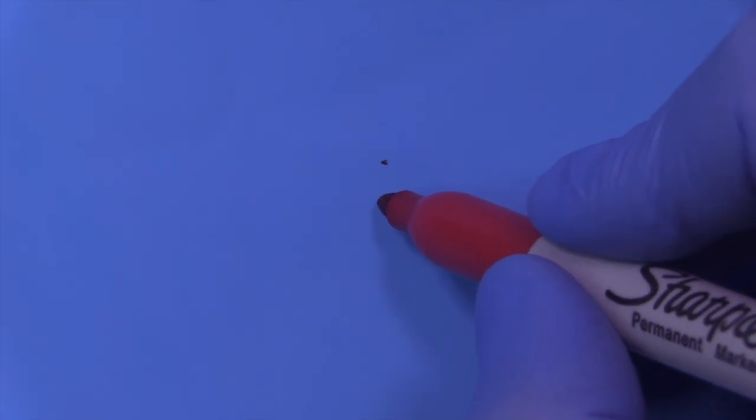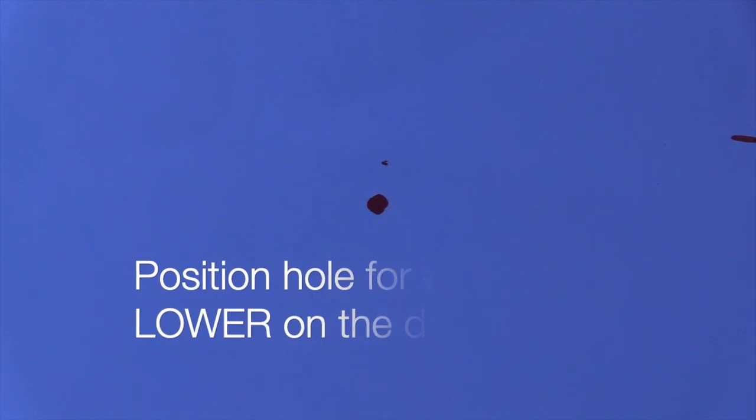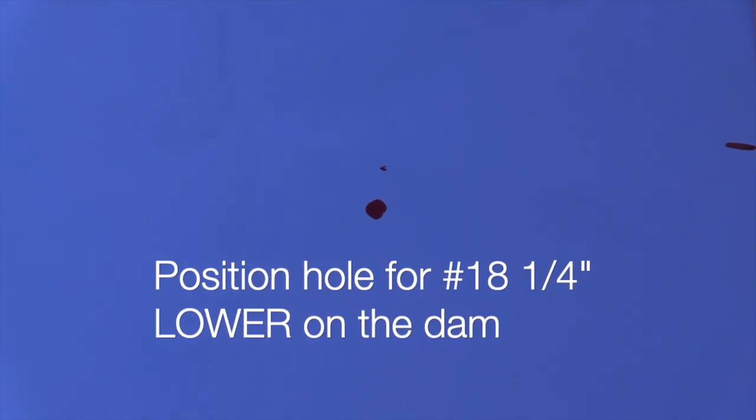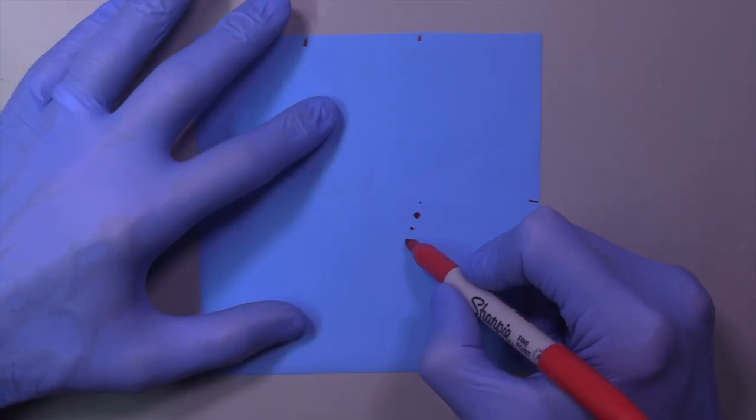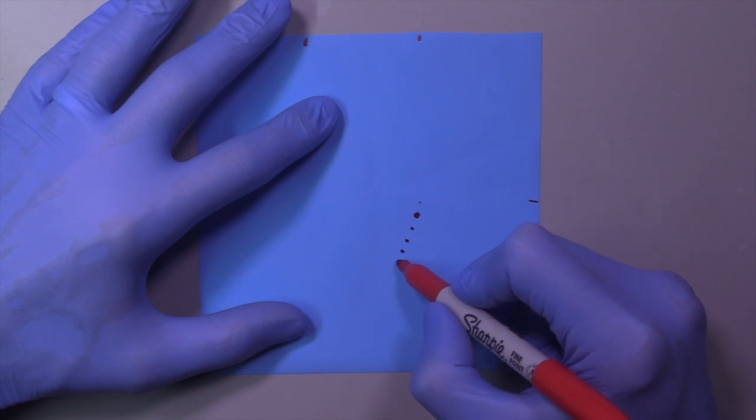So that's the hole for 19. But we're not going to isolate to 19 on this rubber dam. We're going to isolate all the way back to the second molar. So we're going to drop the hole about one quarter of an inch lower on the rubber dam. And a lot of people find this to be counterintuitive. But once you think about what's really happening, it makes a lot of sense.